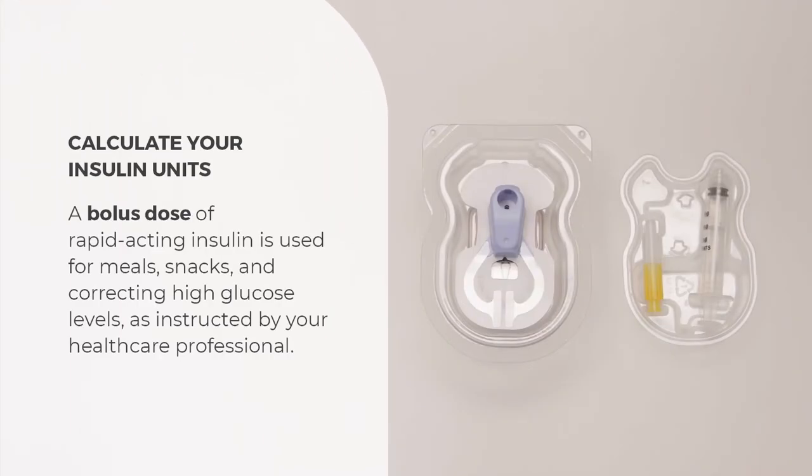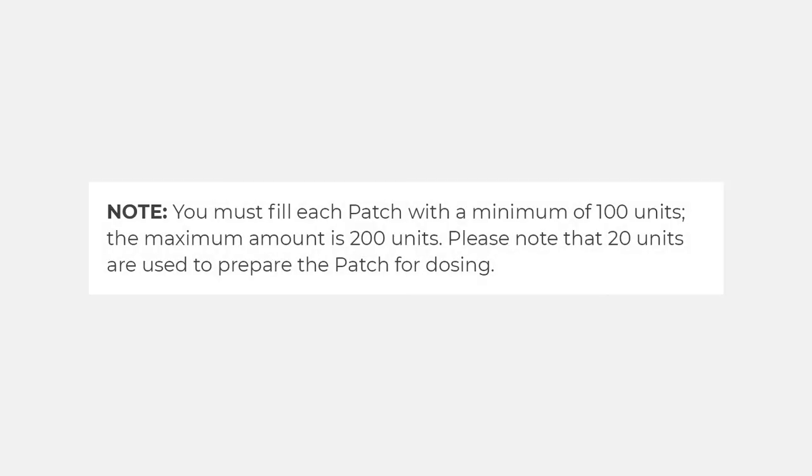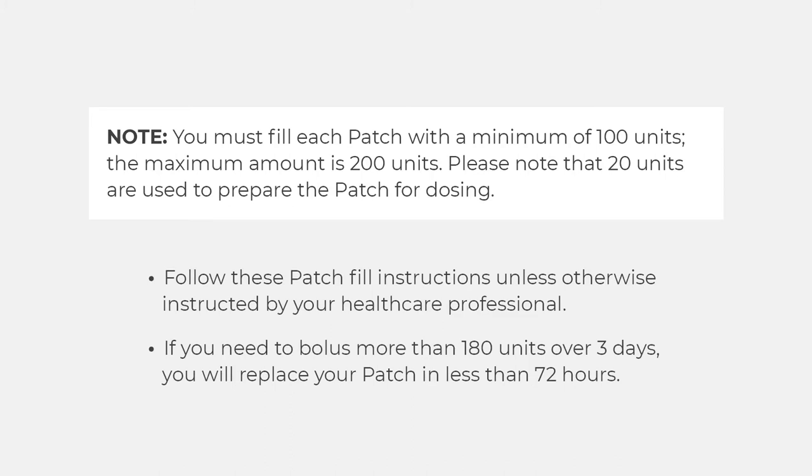Fill your patch with rapid-acting insulin for your bolus dose needs. A bolus dose refers to rapid-acting insulin used for meals, snacks, and correcting high glucose levels, as instructed by your healthcare professional. The patch may be worn for up to 3 days, so fill it with enough insulin to last up to 3 days. You must fill each patch with a minimum of 100 units; the maximum is 200 units. Note that 20 units are used to prepare the patch for dosing. If you need to bolus more than 180 units over 3 days, you will replace your patch in less than 72 hours.